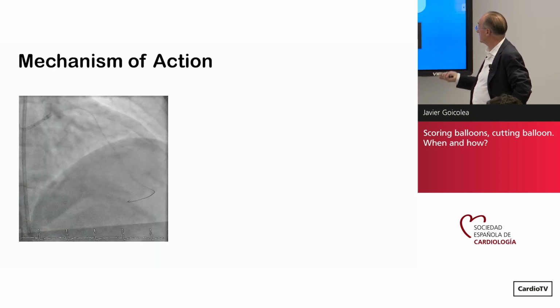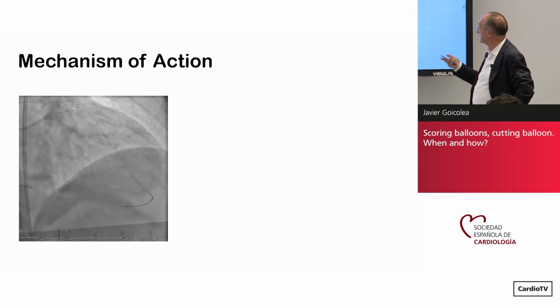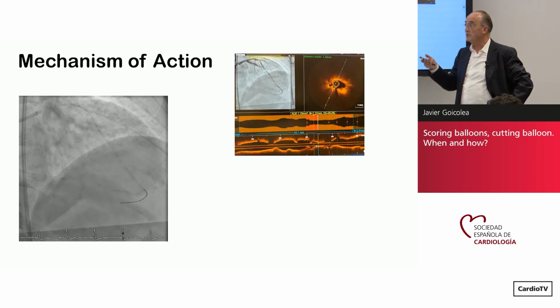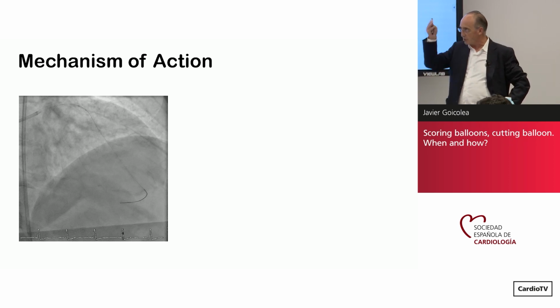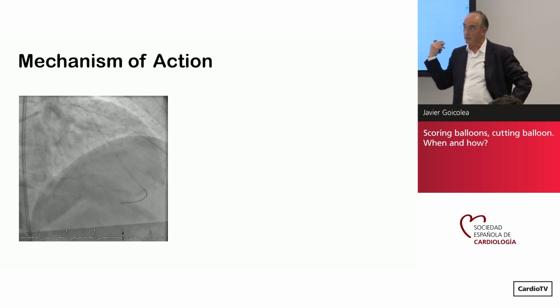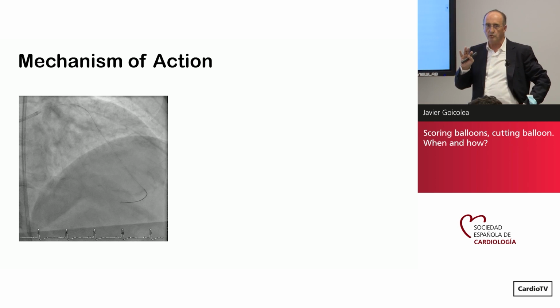The atherotome incises the wall, and what is new is that it is relatively easy to go even distally, and the mechanism is very similar to the one we see with lithotripsy. It's okay to do a cartoon and put a web of cracks and things like that, but I'm not sure. Actually, when we do OCT after lithotripsy, or after scoring balloon, or after cutting balloon, we see 1, 2, 3 cracks. What are we trying to do at that moment?